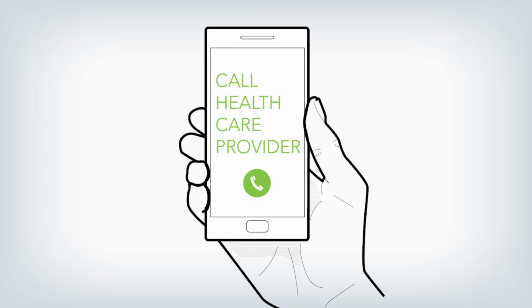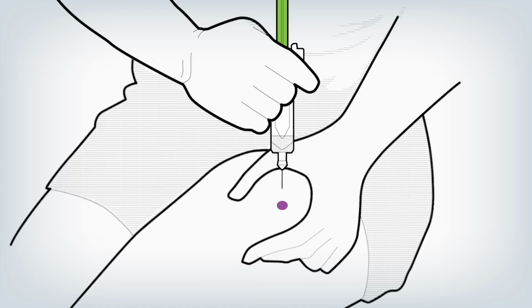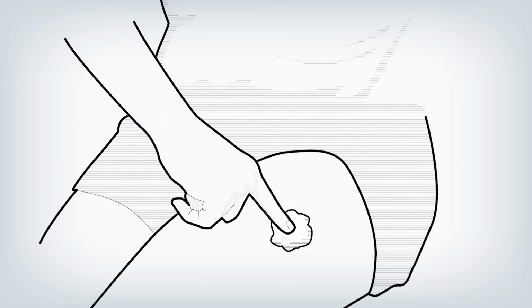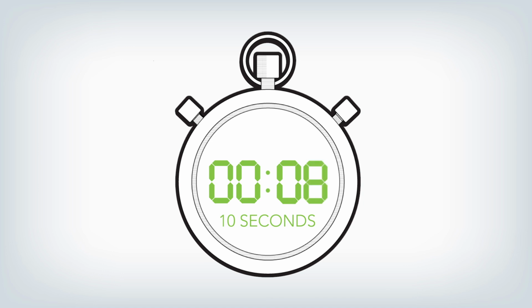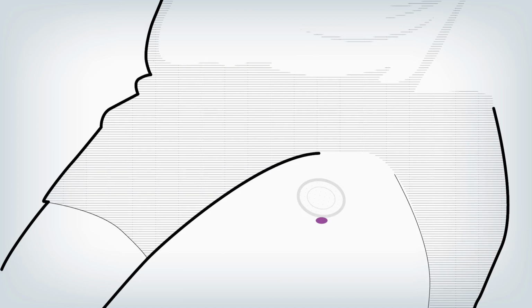If you feel something has gone wrong with the injection, do not try to reuse the syringe or repeat the injection with another pre-filled syringe. Call your healthcare provider for help. After your injection, there may be a small amount of blood or liquid, which is normal. Press a ball of cotton wool or gauze over the injection site and hold for 10 seconds. Do not rub the injection site. If there is any further bleeding, you can apply a small sticking plaster.